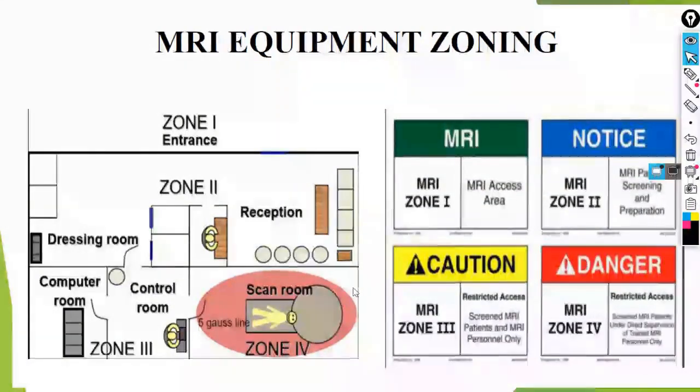According to the vendor, doctor, I have to point out something regarding the MRI zones. As you may already know, there are zone 1, zone 2, zone 3, and zone 4, which are crucial for safety and efficiency in the medical imaging process. These 4 zones have been present in the MRI department for a long time, and have been carefully designed to ensure proper functioning.